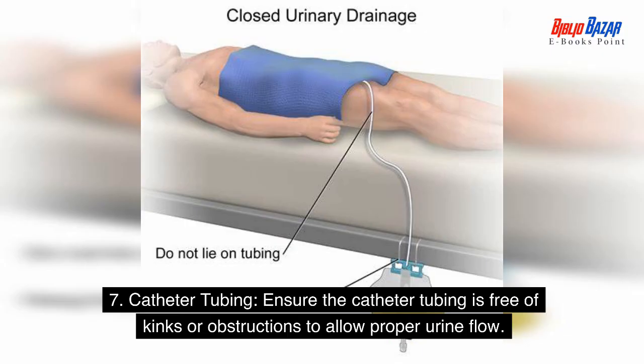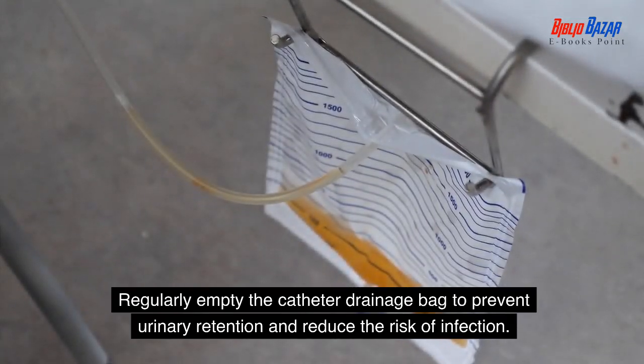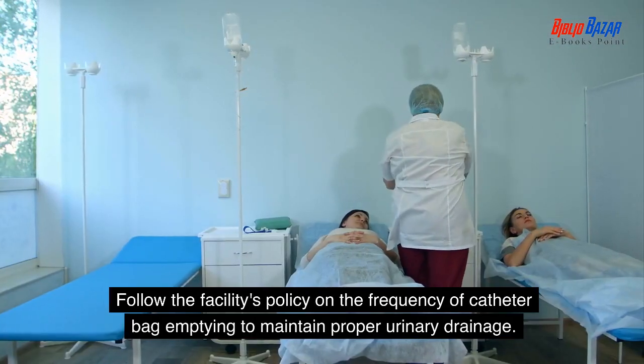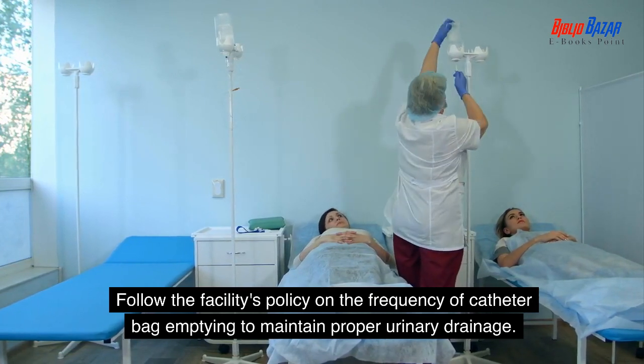7. Catheter tubing. Ensure the catheter tubing is free of kinks or obstructions to allow proper urine flow. Regularly empty the catheter drainage bag to prevent urinary retention and reduce the risk of infection. Follow the facility's policy on the frequency of catheter bag emptying to maintain proper urinary drainage.